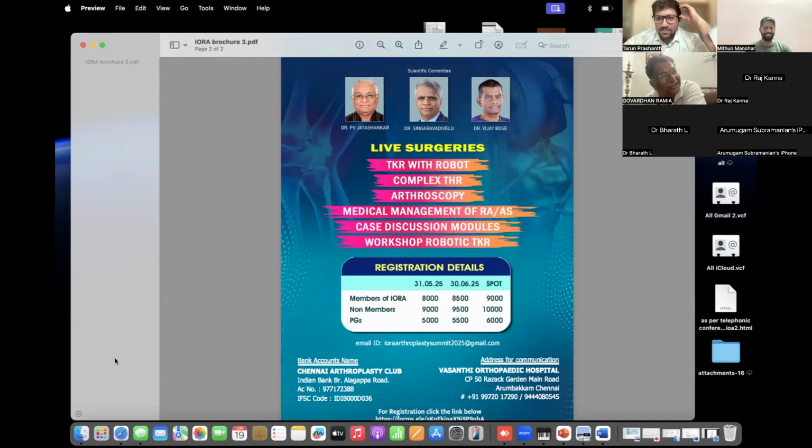Yes. You are going to do the soft tissue releases first, and once you have done everything, usually the balancing is easy in flexion. Balancing is difficult only in extension, in a valgus knee.